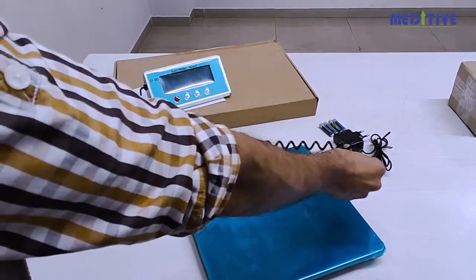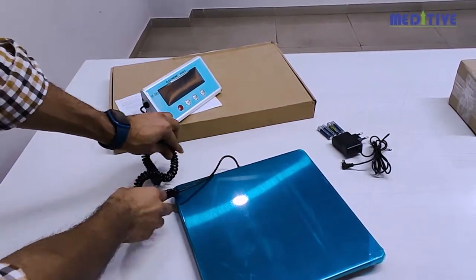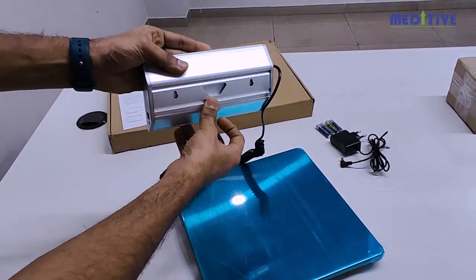The wire is flexible and can extend up to a maximum of one meter. The indicator also has the option to mount it on the wall.